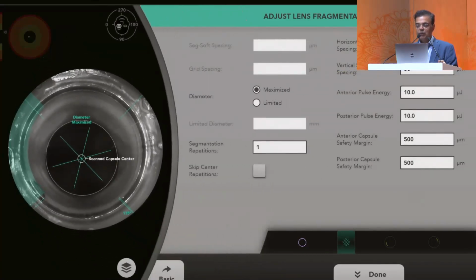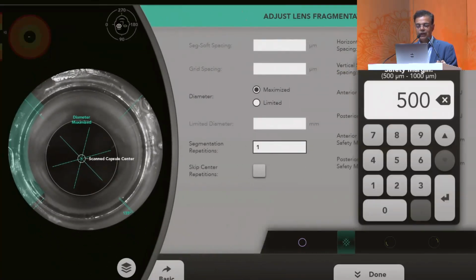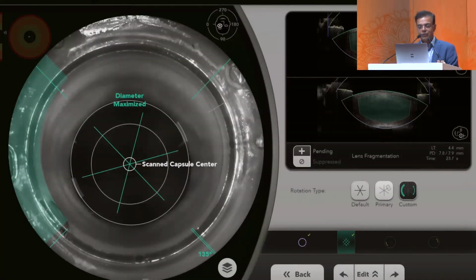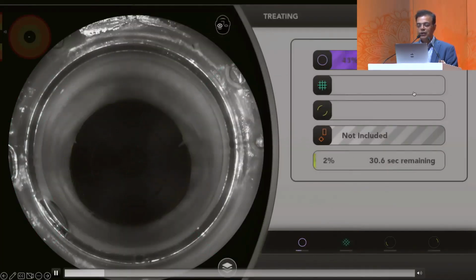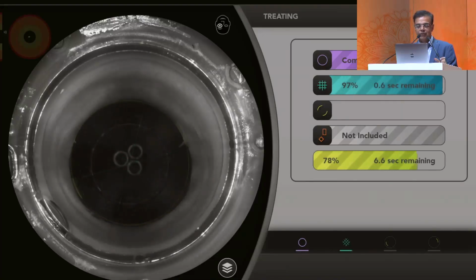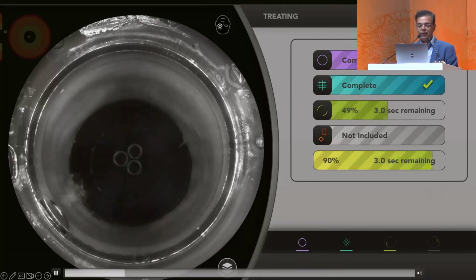You can see that I'm now setting the posterior offsets and then preparing the laser. And here I'm going to change the posterior offset so that I increase the safety margin for the posterior capsule, because that's the area where the posterior polar cataract is limited. So now we are going to fire the laser, which will not reach beyond the 700 micron safety margin from the posterior capsule. Now this ensures that you also have the 6 quadrants, 6 fragmentation of the nucleus is done. And this ensures that you get a good situation.